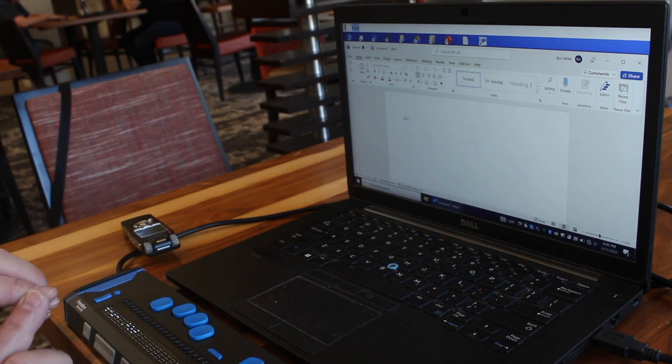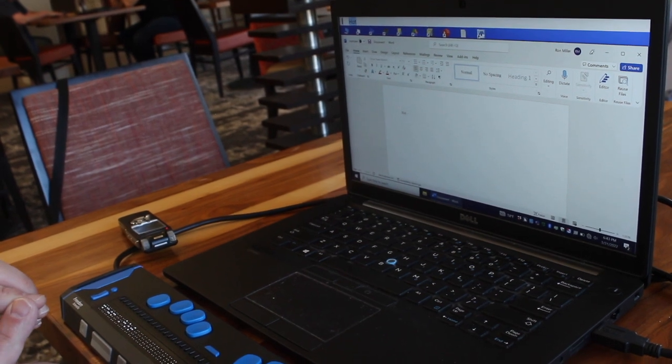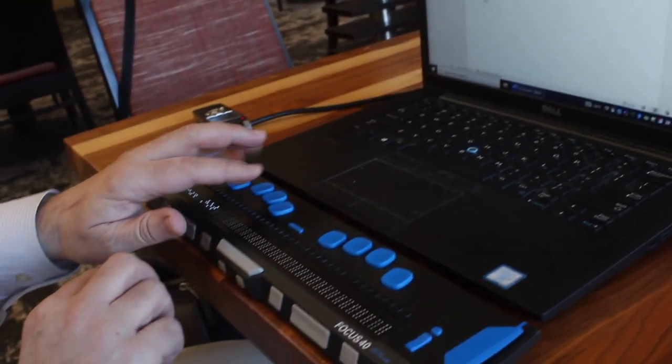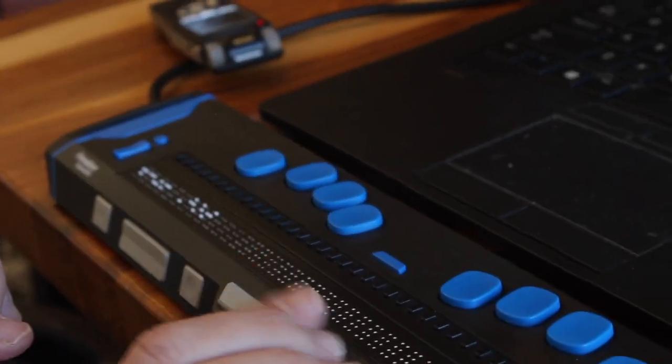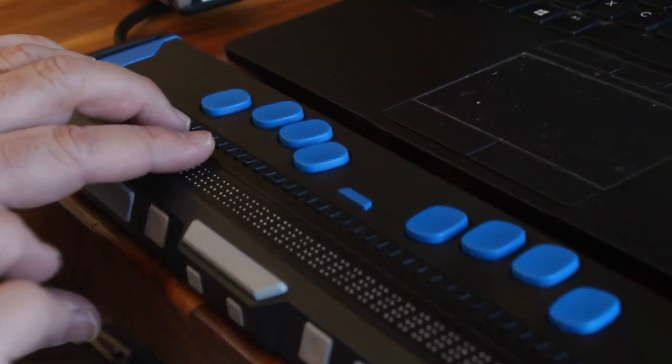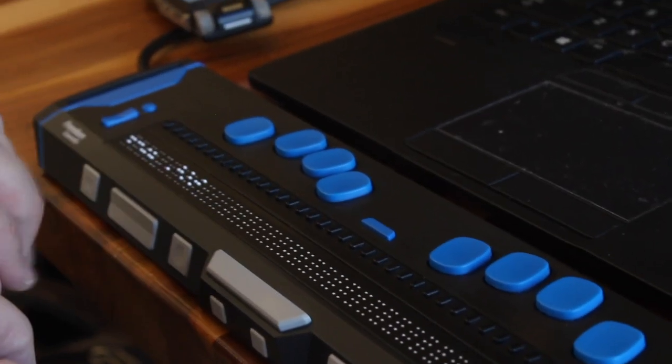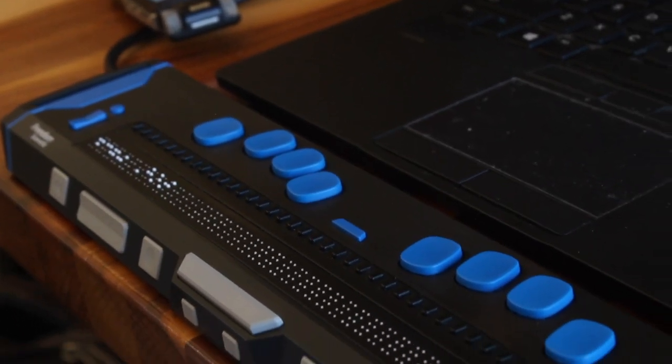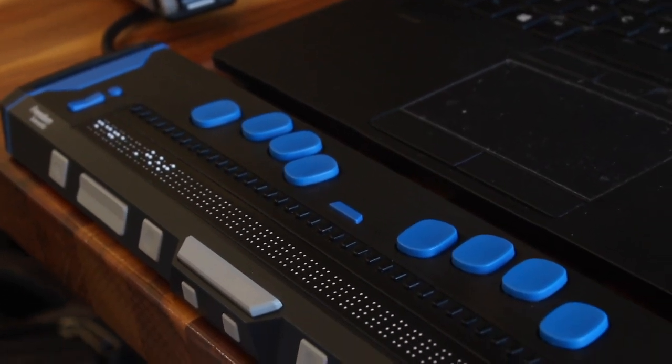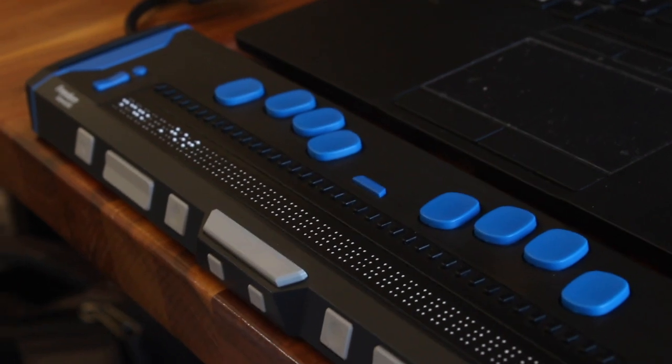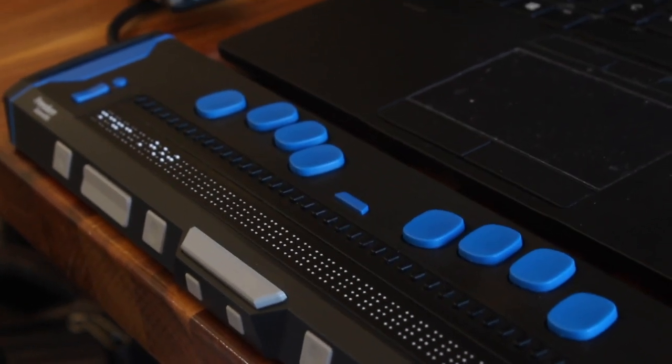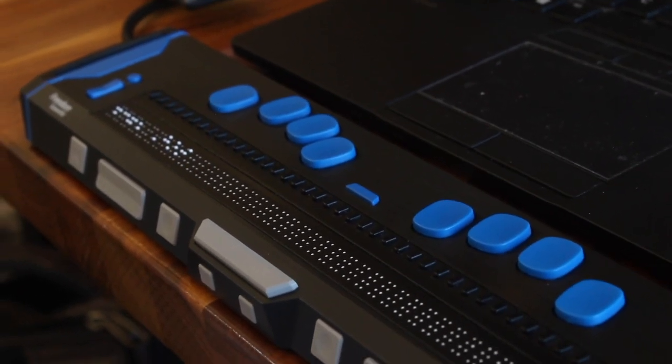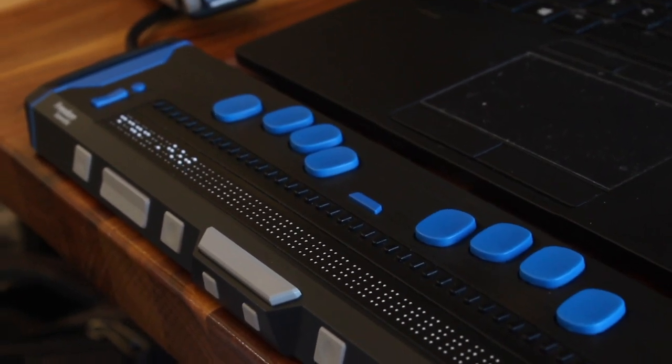Now, if we wish to backspace, I press dot 7 for backspace and then space. Everything we do, every command that we input using the braille keyboard when one-handed mode is invoked, must terminate with a space.